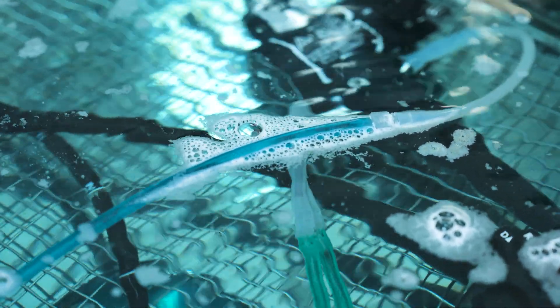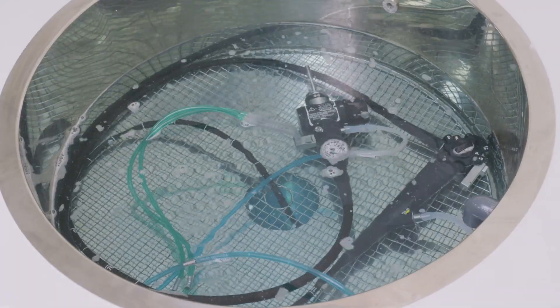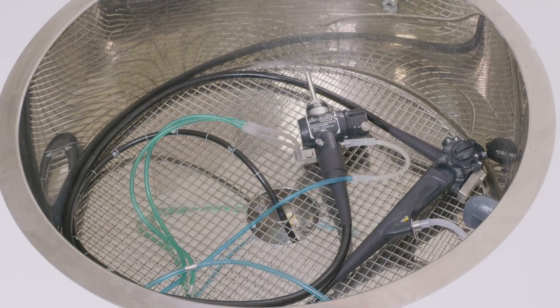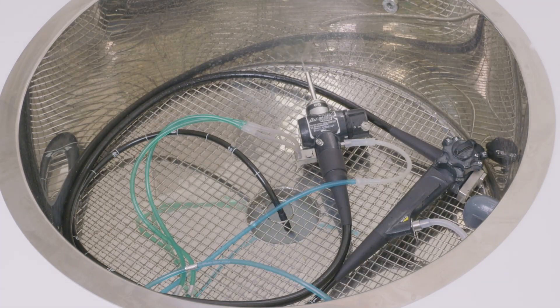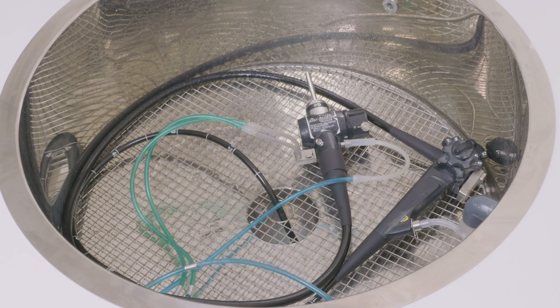To manually clean the endoscope is generally very difficult, and to be trained in how to properly clean it is a lengthy process. The Kamsin takes around 20 minutes to clean an endoscope, taking the same time as it would to correctly clean the endoscope manually.